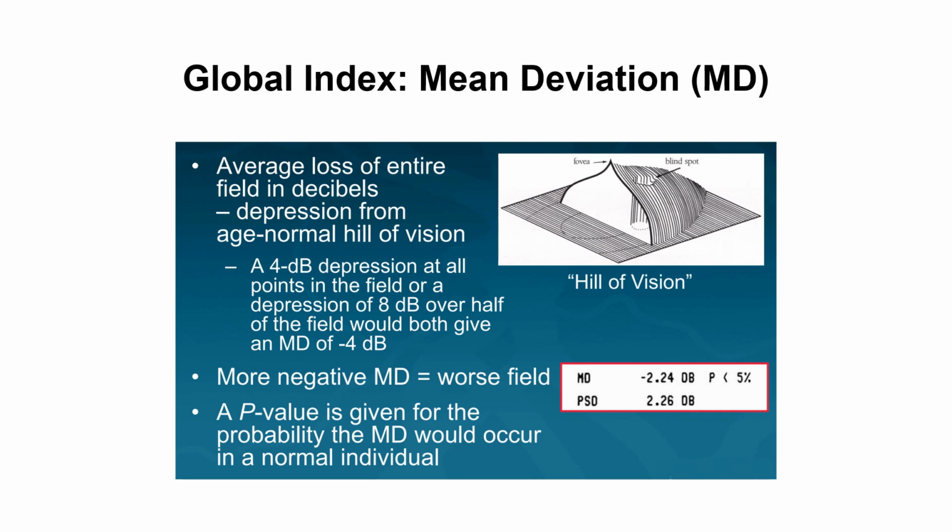As we said previously, the hill of vision is a conceptual model to understand the visual field, normal and abnormal perimetry, representing a hill. The maximum point of the hill is the fovea, where there is the maximal visual threshold sensitivity, and when you go to the periphery there is a reduction in retinal sensitivity. In a glaucoma patient, they will start losing in the periphery. However, a patient with optic neuritis, for example, will start losing the central hill of vision.